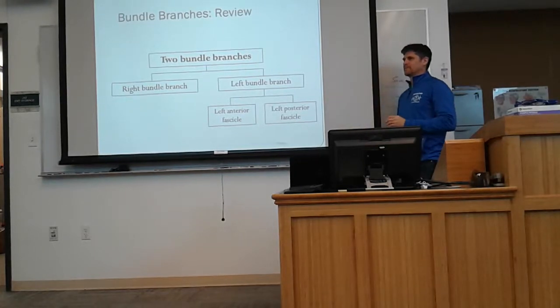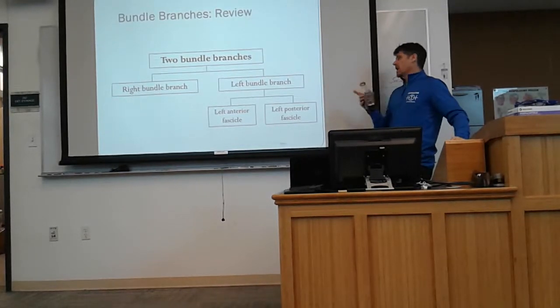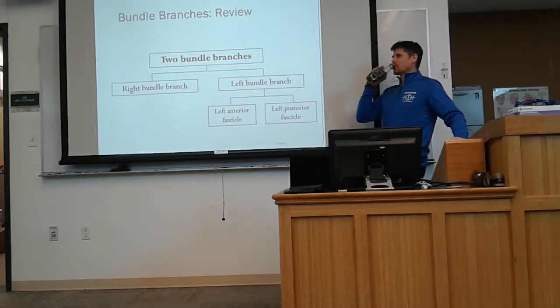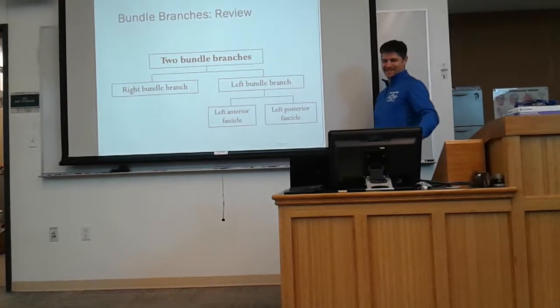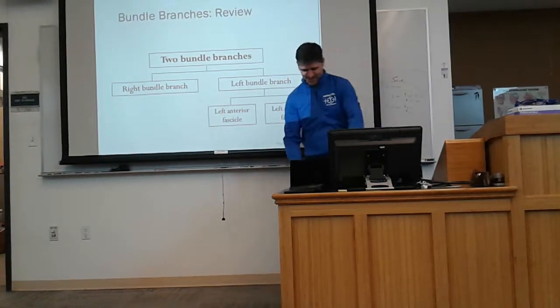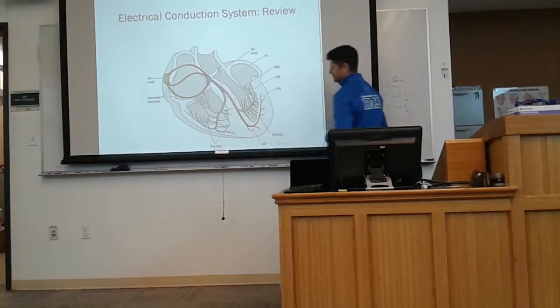And we're going to go over determining where it's at. Or an event that has occurred. We can't tell if it's current or not, if it's dead tissue. It's not a new one, right? Which you'll take with your history, that you'll write down in your really well-written narratives. Good? Okay. All right, so we are looking here and here.